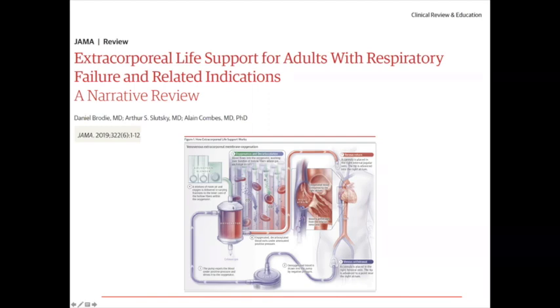called an oxygenator. And truthfully, we should call it a gas exchanger, not an oxygenator, because it both provides oxygen and removes carbon dioxide. That oxygen comes just from a blender, just like it does with a ventilator. It's either pure oxygen or a mixture of air and oxygen, and that's added into the oxygenator. This is what goes on inside the oxygenator. And here it says oxygenation and decarboxylation. That's actually a misnomer. We shouldn't have called it that. It's just removal of carbon dioxide.